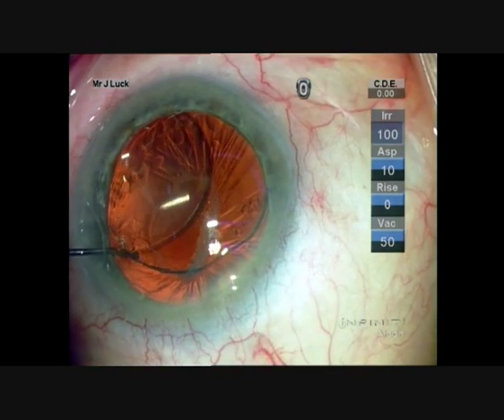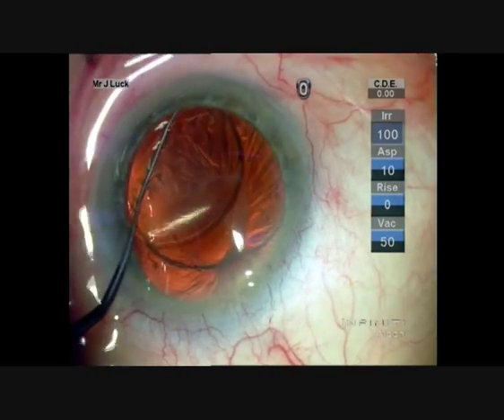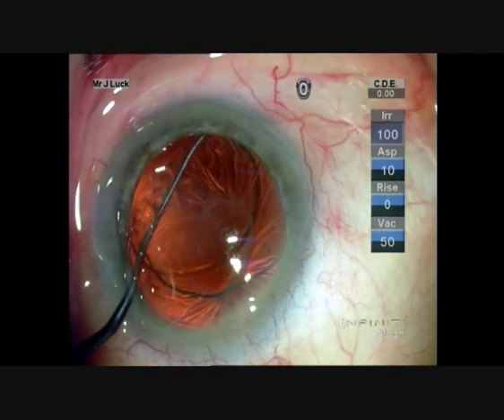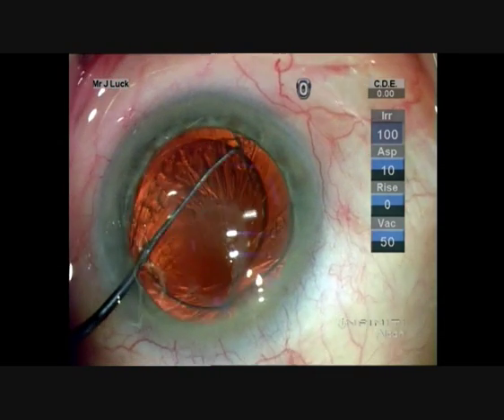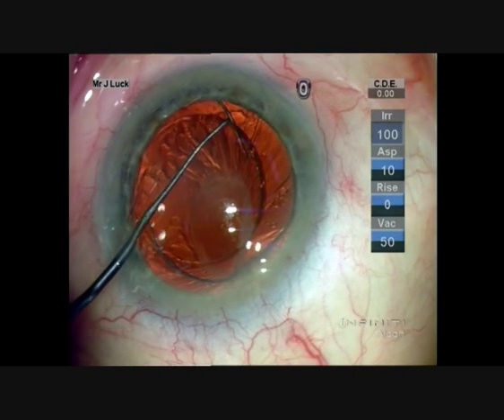The options here are to leave it in the sulcus — these lenses sit quite well in the sulcus. You can suture the haptics to the iris using a Sipsa sliding knot technique, or you can put in an anterior chamber lens. This was considered to be the best option at the time.